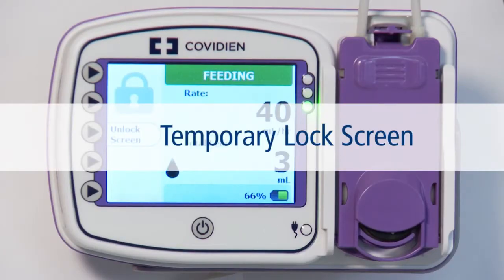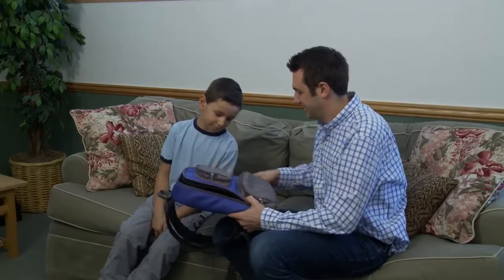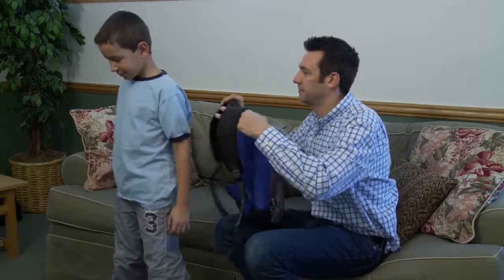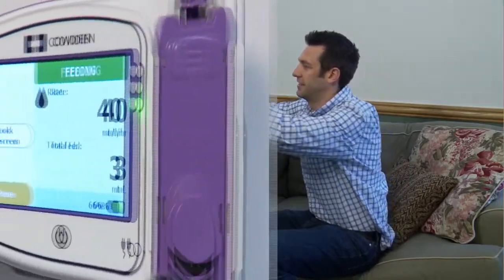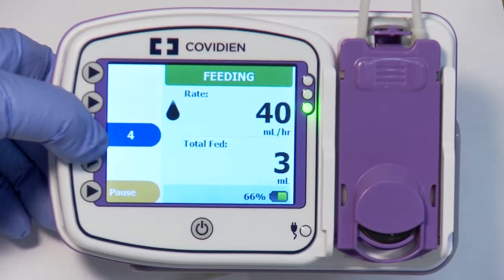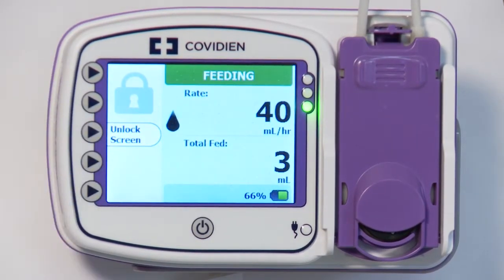The pump allows the user to lock the input screen to prevent accidental button presses during portable use. This is especially helpful when transporting the pump in a backpack. From the pump feeding screen, press and hold the Lock Screen button for 5 seconds. A countdown will appear to show how long to hold the button.